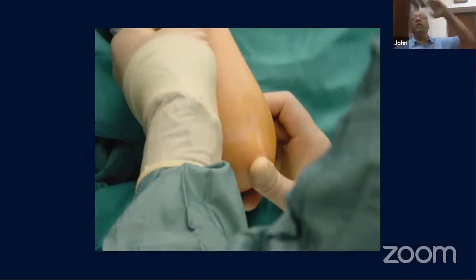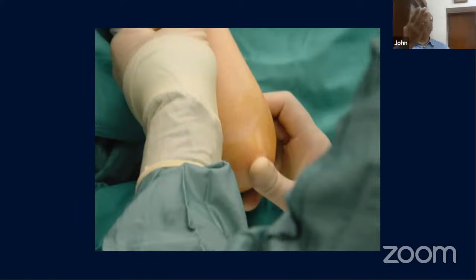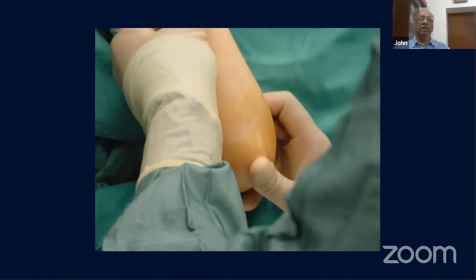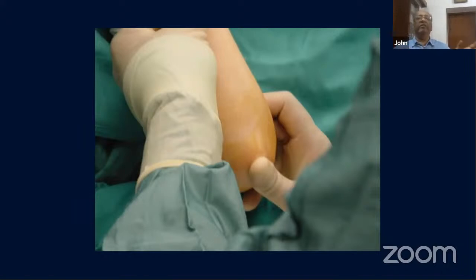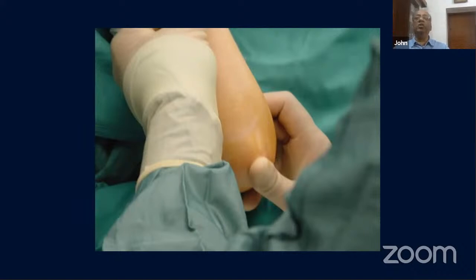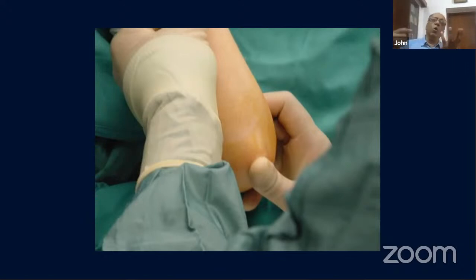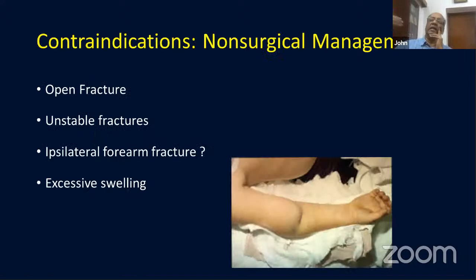Your OT setup is important. Rotating the arm to get a lateral view may displace the fracture, so set up the C-arm so you can rotate it instead of the arm. Once wires are placed, you can rotate the arm to check. Some people tape the arm in a flexed position or have someone hold it while placing wires — usually the lateral wire goes in first.